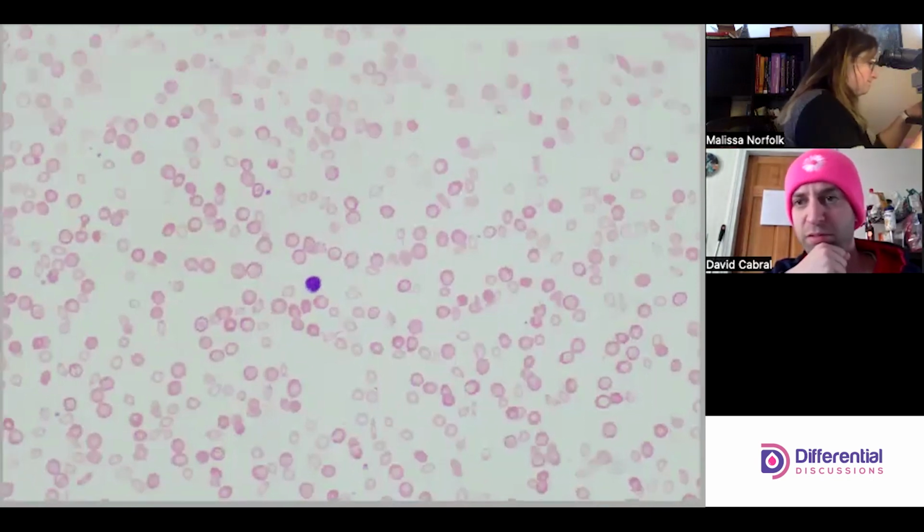Maybe as good a time as any. Spin down to oil.